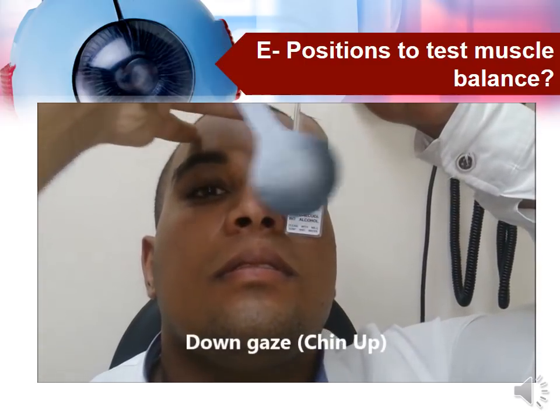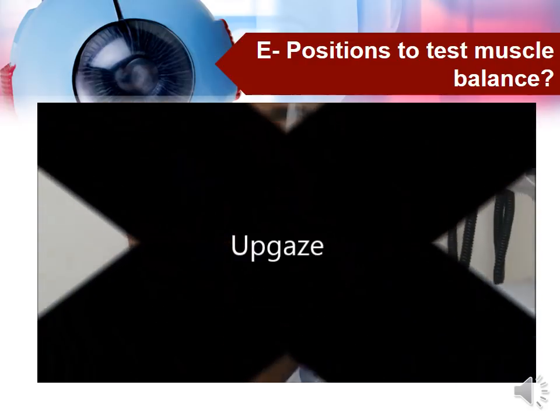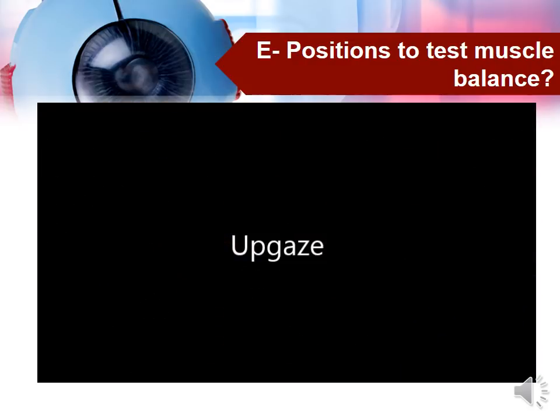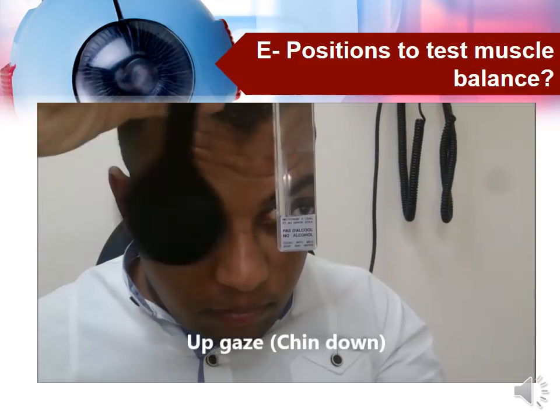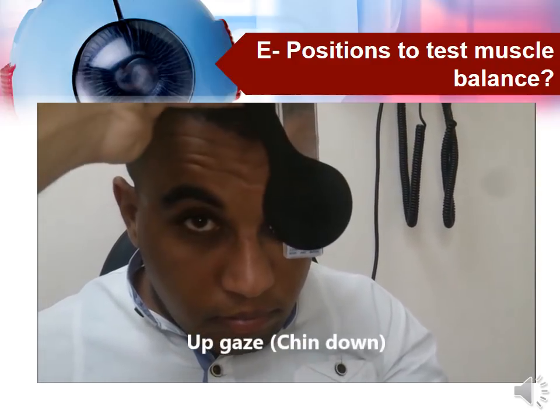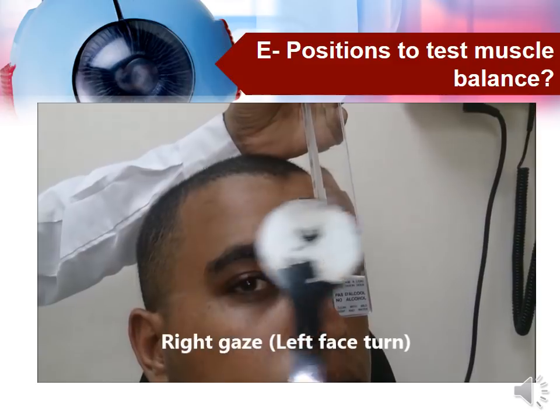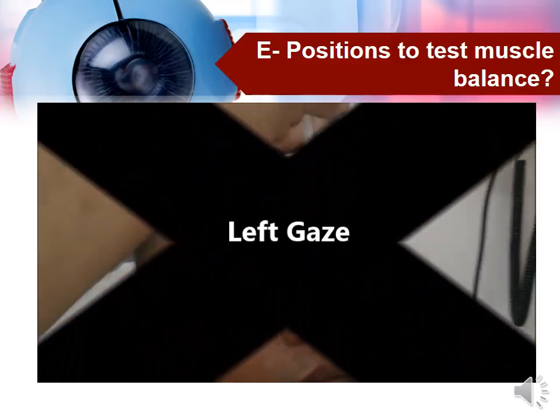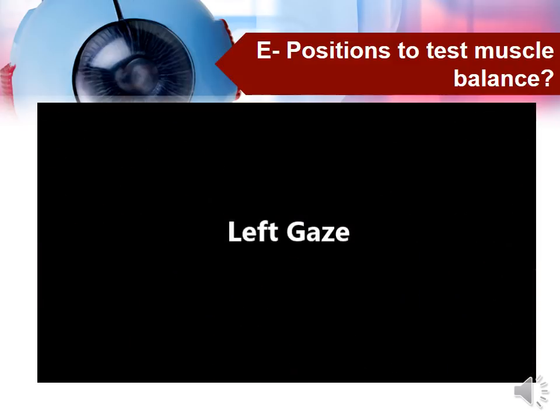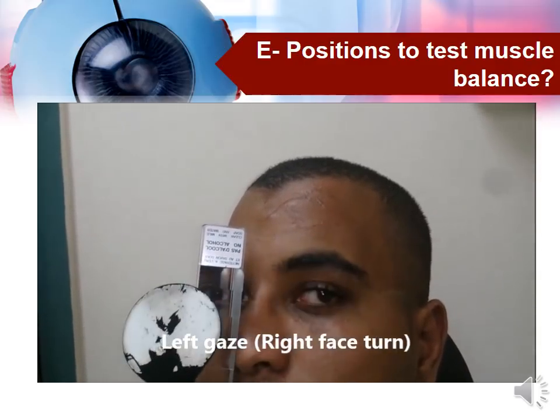And then in down gaze using a chin up position, and in up gaze using a chin down position. Then we measure the angle in right gaze by turning the face to the left, and in left gaze by turning the face to the right.